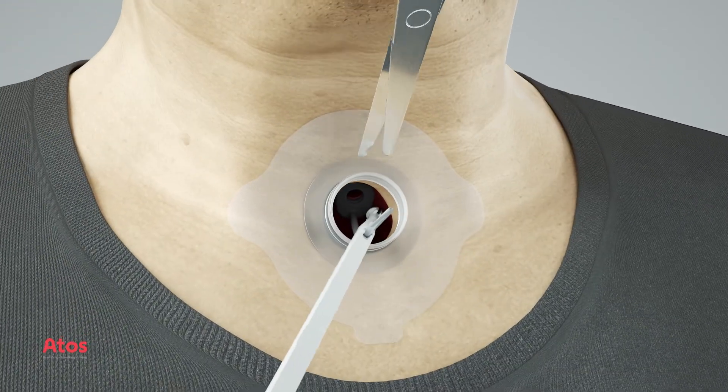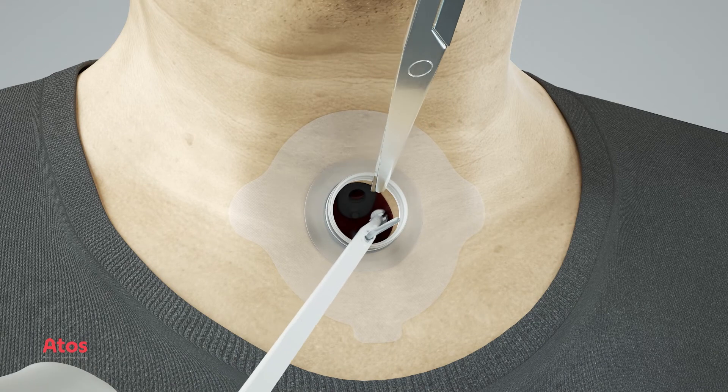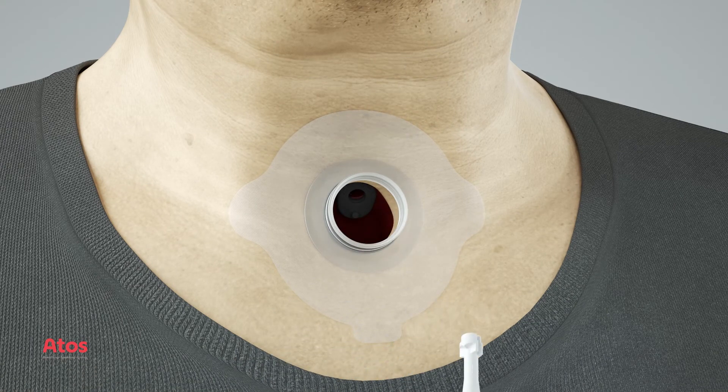Cut the strap while it is still attached to the insertion pin and remove the insertion pin together with the strap. The Provox voice prosthesis is now ready for use.